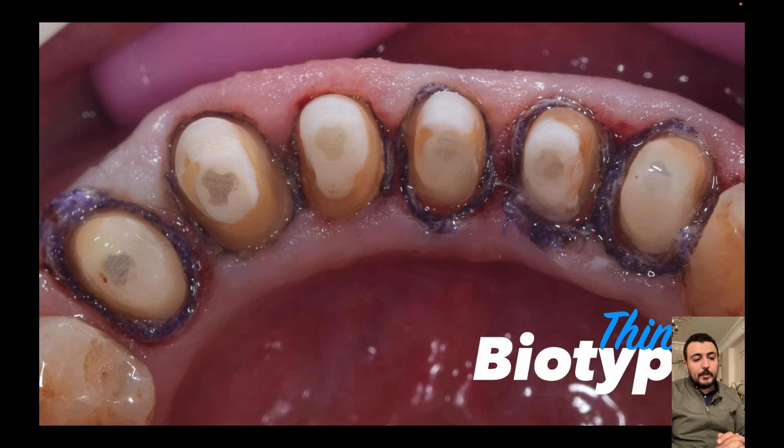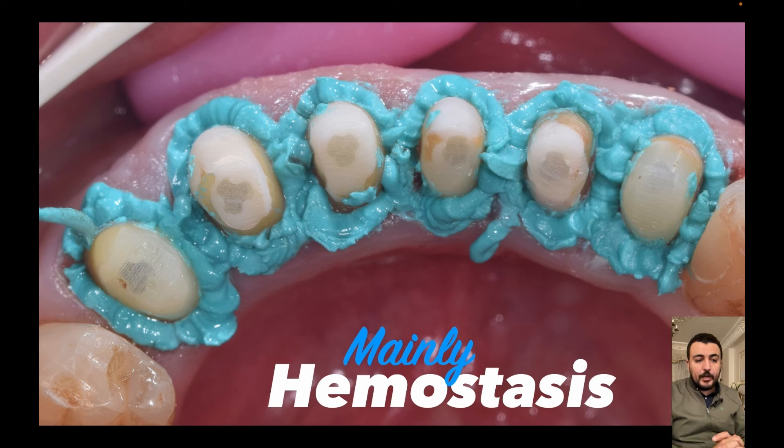Placing a single cord might not be sufficient to make ideal retraction, also for hemostasis. In these situations we need another material that can cause more vertical and horizontal displacement for the tissue, and also hemostasis. I'm using retraction paste which contains aluminium chloride. This paste is efficient for hemostasis because of the effect of aluminium chloride, but it is not efficient for achieving good vertical and horizontal displacement, because the minor displacement caused by this material is only caused by the viscosity of the material when placing and injecting into the sulcus. So we need another material to achieve ideal retraction.